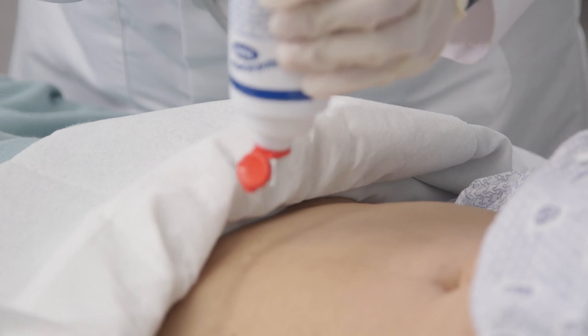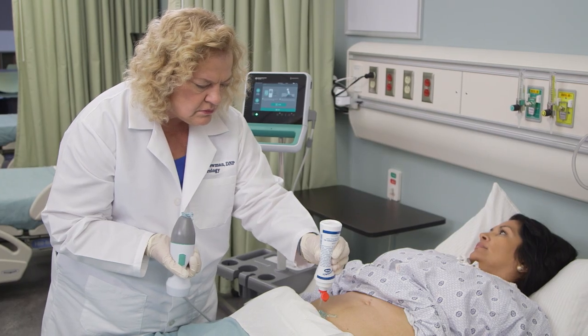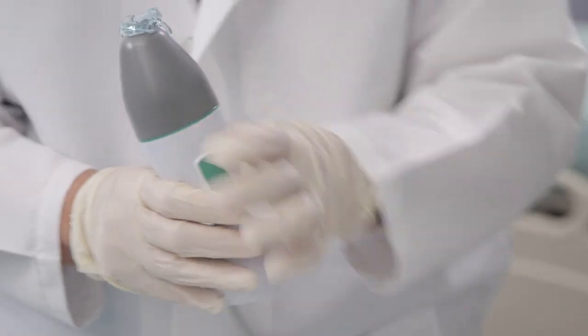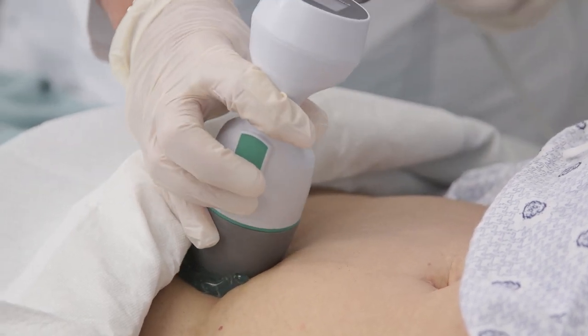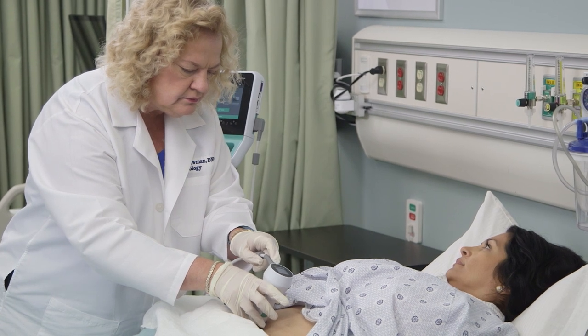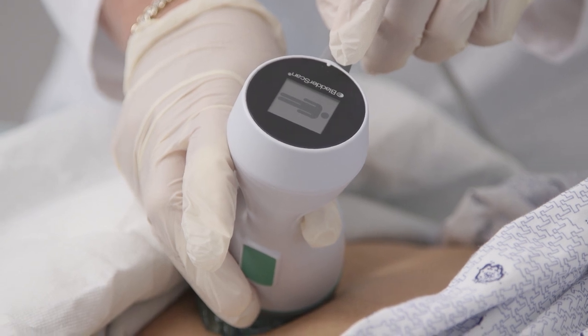Apply a generous amount of ultrasound gel to the probe or directly on the patient's skin. Be careful not to touch the gel bottle tip to the probe or the patient's skin as this risks cross-contamination. For best results, keep the gel in a thick layer. Don't spread the gel too thin as this may result in poor contact between the ultrasound probe and the patient's skin. Using the icon on the probe display, be sure to align the probe with the long axis of the body.